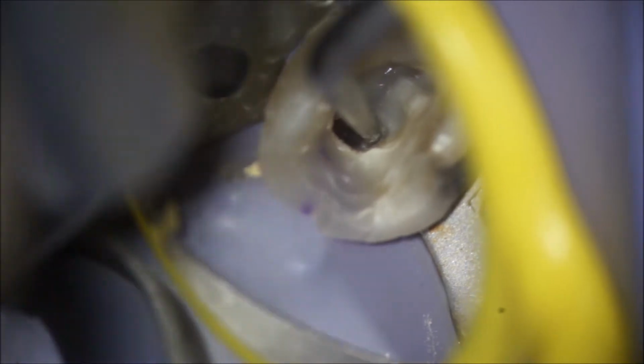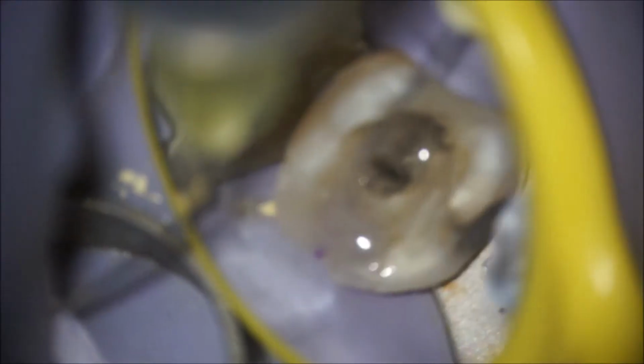After the bulk of the tissue is removed, I switched to the Startex number 2. This one has got an active tip, but it's rounded. I would not recommend Startex number 3. I think it would damage the already thin dentin walls. The number 2 worked well to get the last of the flaky dentin chips out of there.